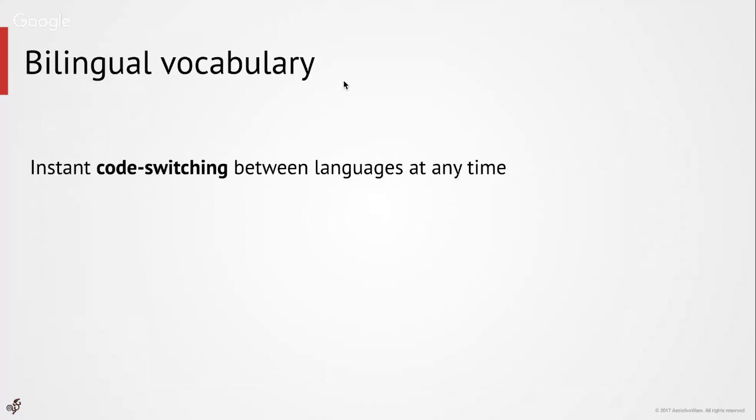So it's important that the AAC system takes this behavior into account and allows the mixing of languages even in mid-sentence in an extra quick manner, because that is the way people in this community speak. So what we need to represent in our system is the reality in which they live.